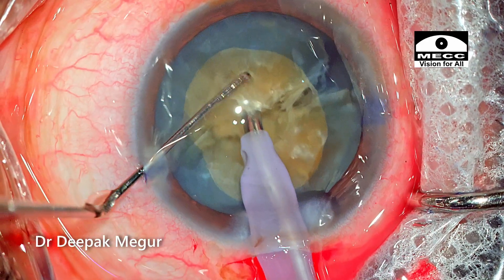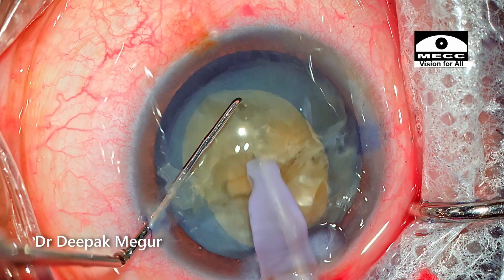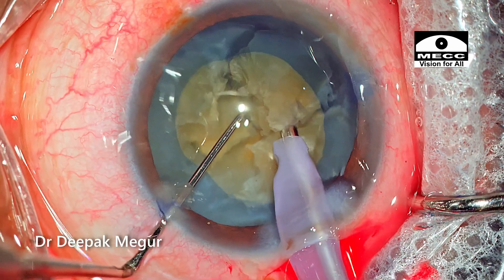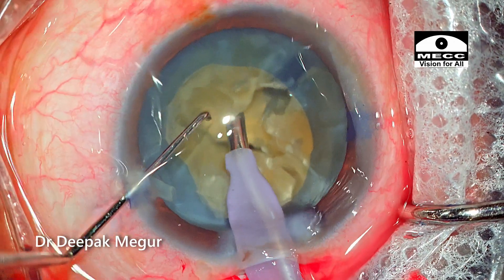The tip is buried again and pulled towards me so that I can see the equator quite well. Then the Sinski hook hooks around the equator and scores the nucleus quite easily into pieces. The same process is repeated.